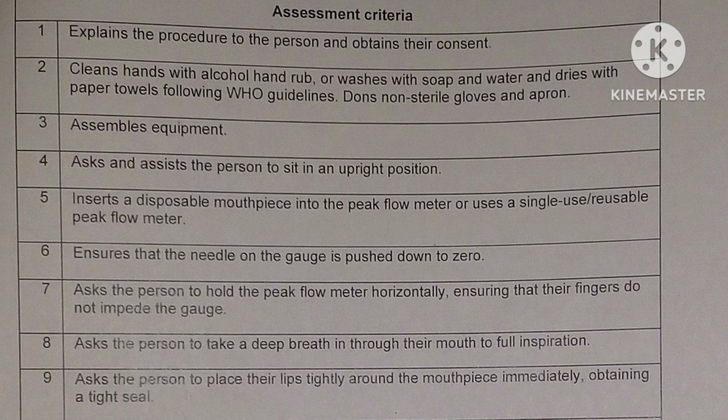So we can say, peak flow measures your peak expiratory flow, which is the highest flow of air achieved on forced expiration, which will assist us and you to monitor your respiratory condition and the effectiveness of your medication. So they will get some idea what is peak expiratory flow measurement. Then we have to ask them, are you in a comfortable position to do this procedure? Do you need any assistance? Do I help you to sit in an upright position like that?